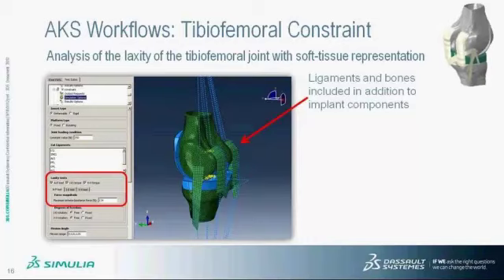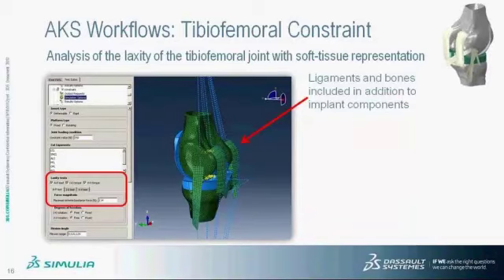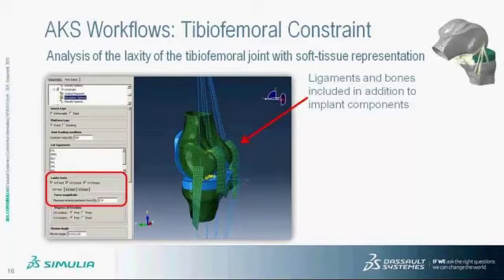Similar to the previous workflow, a number of laxity tests are included in workflow 3, and they are the anterior-posterior load, internal-external torque, and valgus-varus torque. As you can see here, the loads are applied directly instead of displacement.